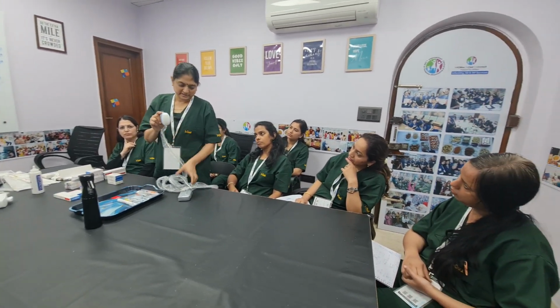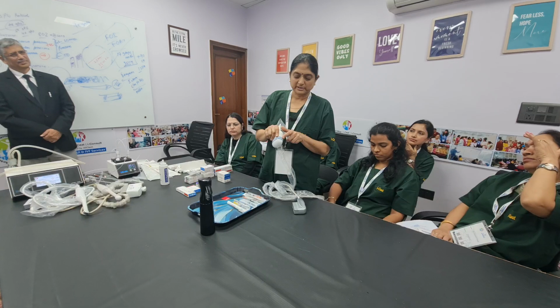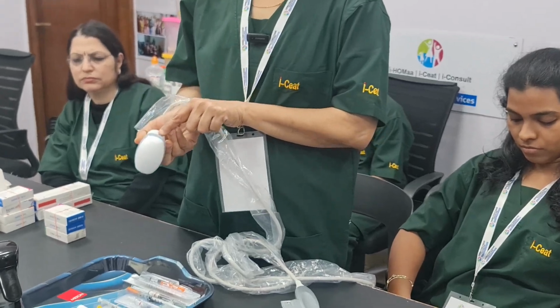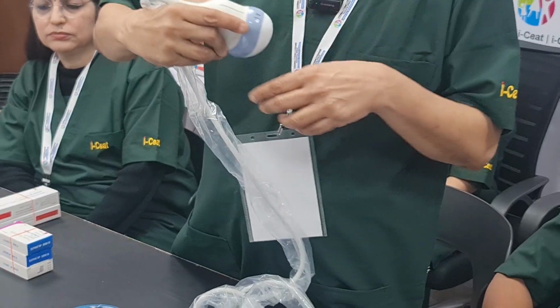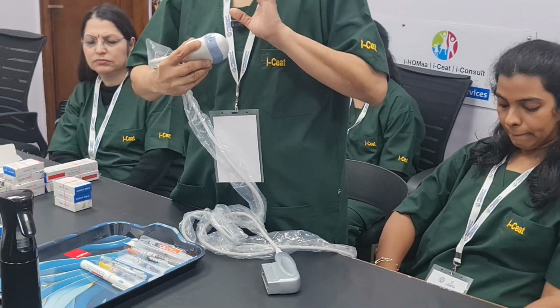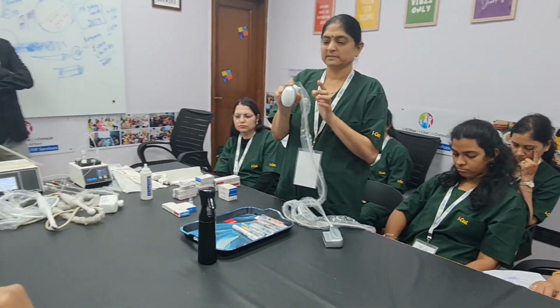This is fixed to the ultrasound machine, and we have the probe, and you have to know which side is anterior and which is posterior. For that we have a marker here. Each probe has a different way; the other side will be posterior, will be a dot. Suppose I want to do the upper abdomen, so this has to come to the upper side. If you do it the other way, the whole image will reverse. Breech will turn cephalic, cephalic will turn breech, it will be a disaster. So we need to hold the probe like this.